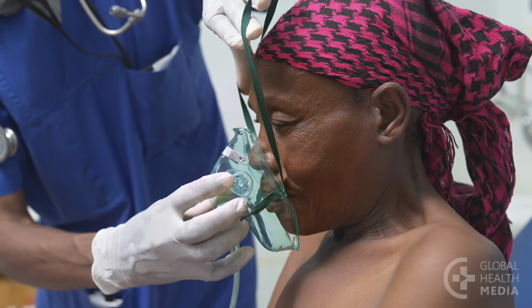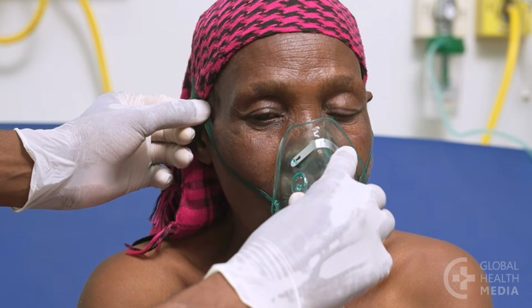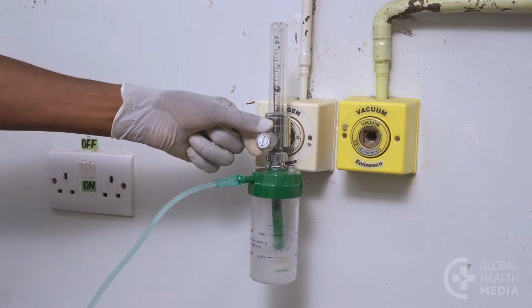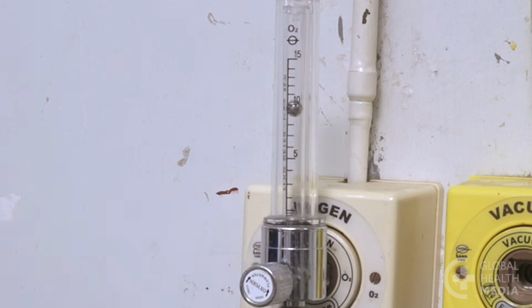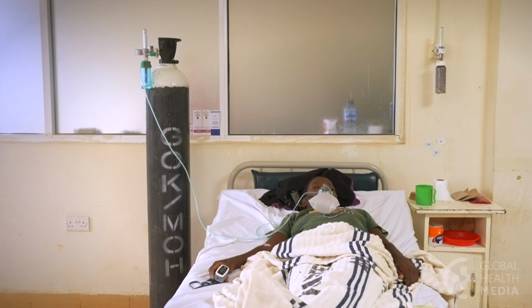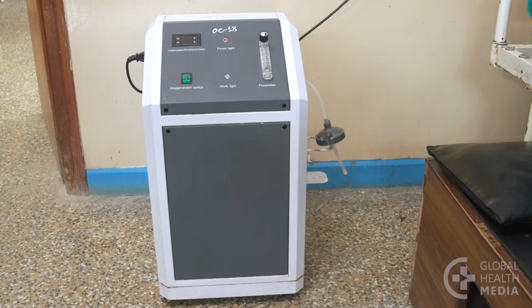Place the face mask on the face, then pull the strap over the head. Adjust the elastic and pinch the nose of the mask to reduce air leaks. Increase oxygen from 6 to 10 liters per minute. If the patient needs more than a nasal cannula, you will either need wall oxygen or an oxygen cylinder. An oxygen concentrator typically cannot deliver oxygen higher than 5 liters per minute.